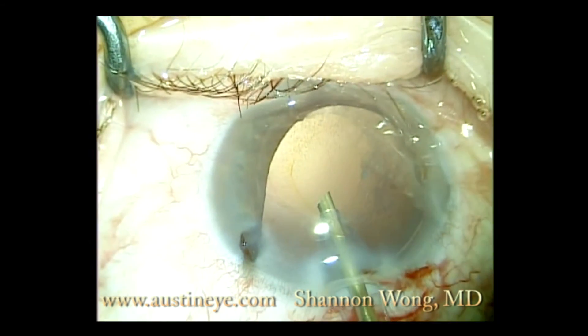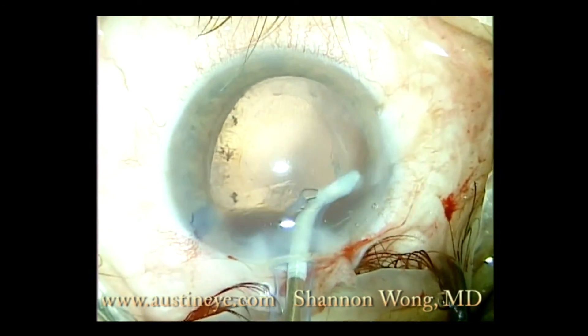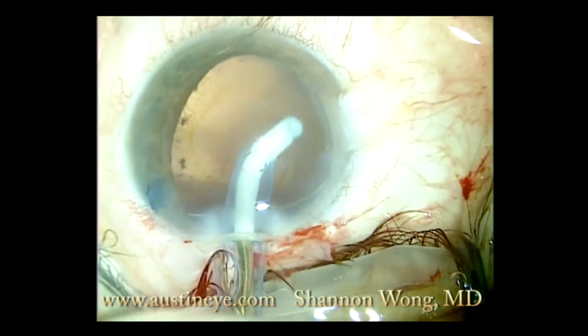Once we've removed the nucleus, we proceed with normal uneventful cortical cleanup with the irrigation and aspiration handpiece.